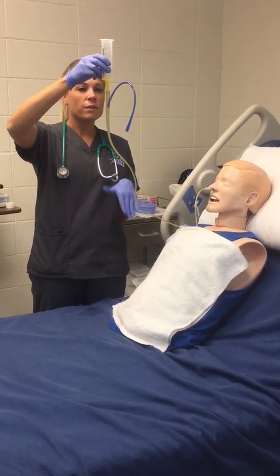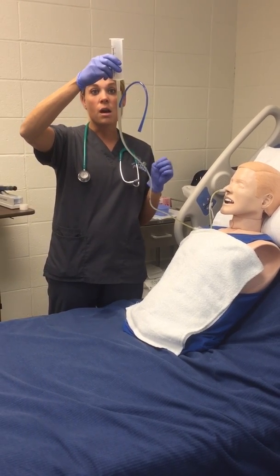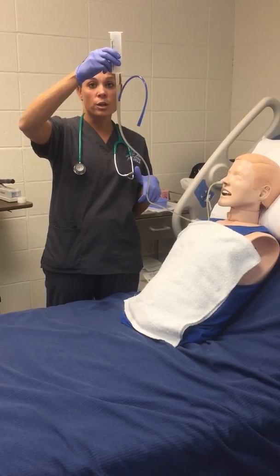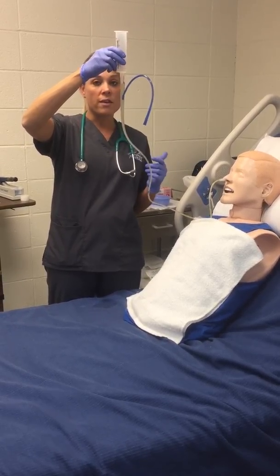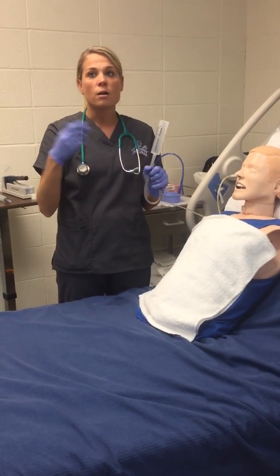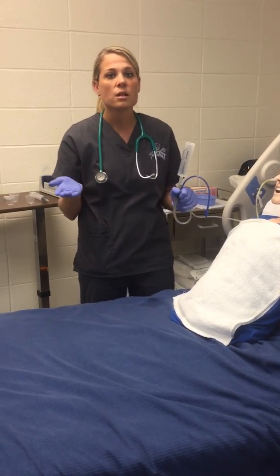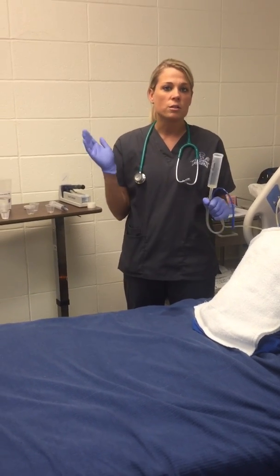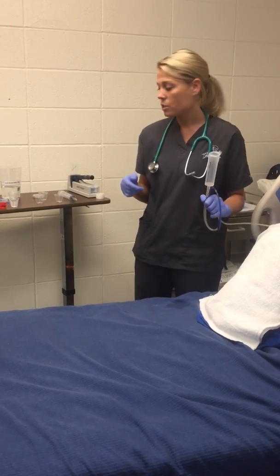Before I would have done any of this, after checking placement of the tube, I would have pulled back some residual volume. If the patient had been on tube feeding, or even if they haven't, I would still pull back residual volume, and depending on how much volume is left, would act per doctor's orders of what to do with the medications. But in this case, for the video, the residual volume was fine, so you would just push that back in and carry on with the flush and medication.